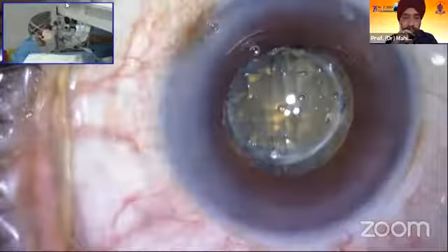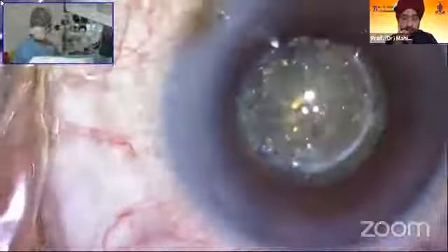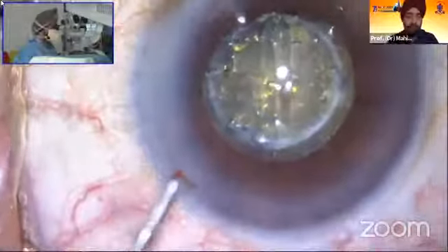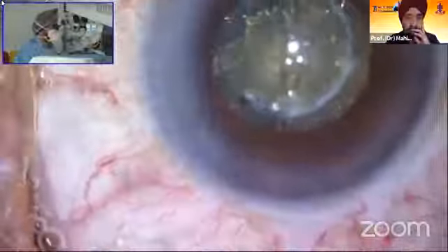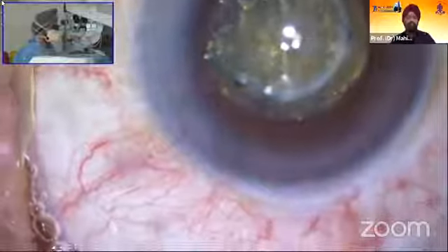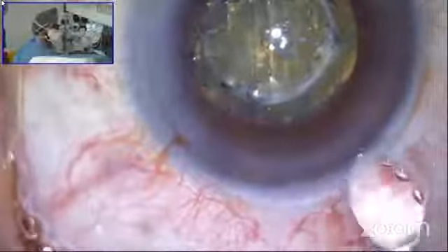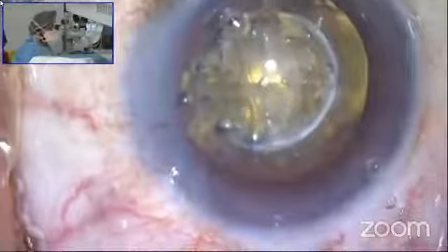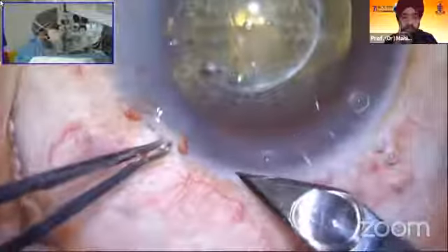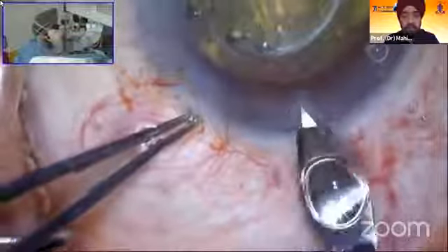I'm going to use the Signature Pro machine. The nucleotomy is visible very nicely. I made the side port. You can see it's a free-floating capsulotomy — I just put phenocaine and will wait 15–20 seconds. You can see that the pupil, which was earlier at the rim of the capsulotomy, is beginning to move. The free-floating capsulotomy is visible and it's pretty good. One of the important things about the Catalyst is that the vast majority of the time you get a free-floating capsulotomy — you can actually pull it out with the phaco probe itself.